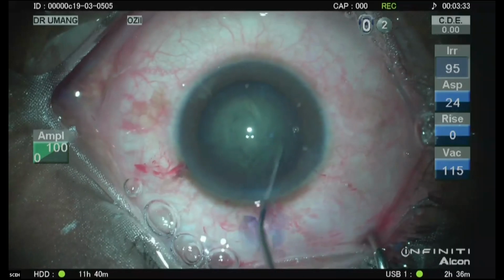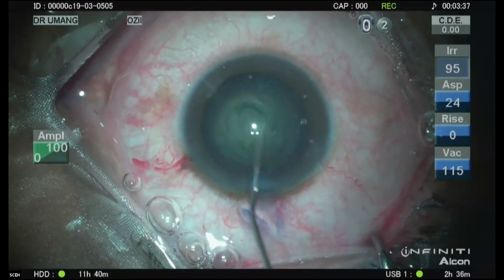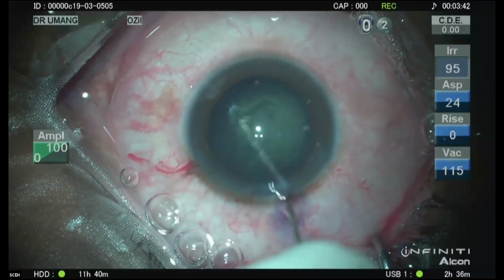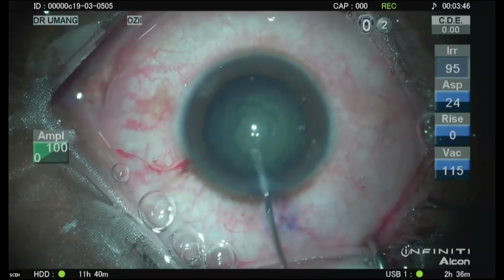You can see adequate movement. You can try some delineation. Now, hydrodelineation sometimes may not be visible in all cases. It depends on the kind of grade the cataract is.